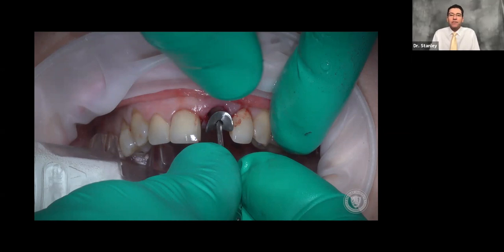We're going to put this in — it does a couple of things. Number one, it holds those papilla. As I mentioned, if you lose the papilla, it's really a prosthodontic and periodontic nightmare trying to grow them back. If we put this in and hold that papilla on the mesial, distal, and facial keratinized tissue during the healing process, it's a whole lot easier later on to get a good solution. The second thing is it creates a roof right over our bone graft, holding it intact in the hole — another reason we don't need a barrier membrane. No sutures needed since we didn't pop any papilla and have no loose tissue. That saves on suture money, saves time, and there's no suture retrieval appointment necessary.